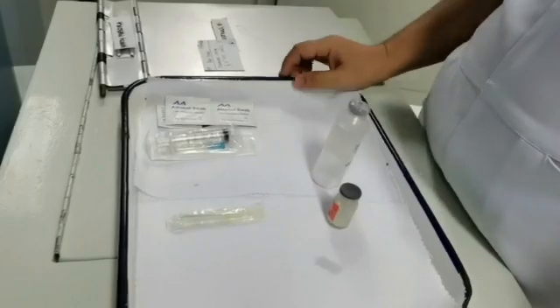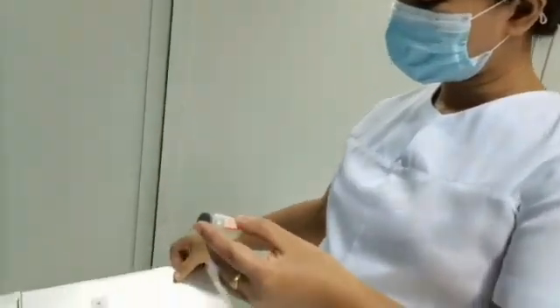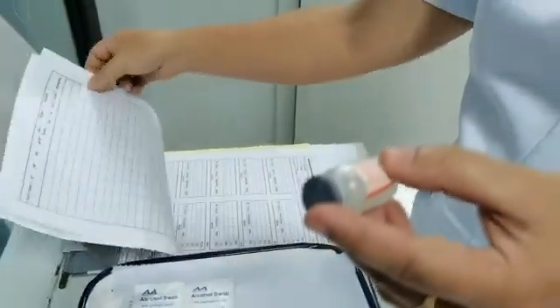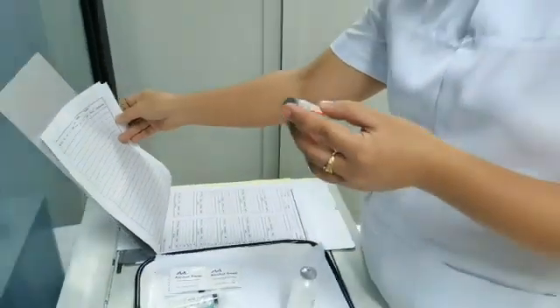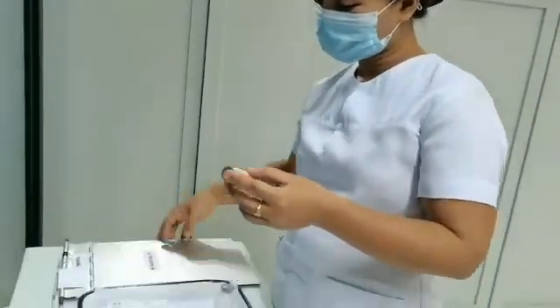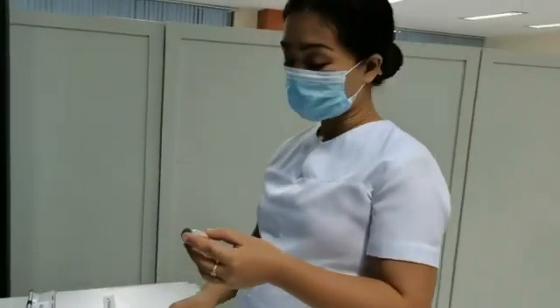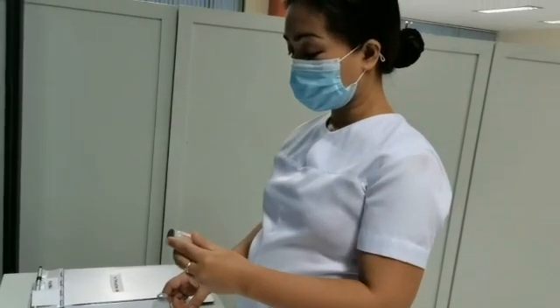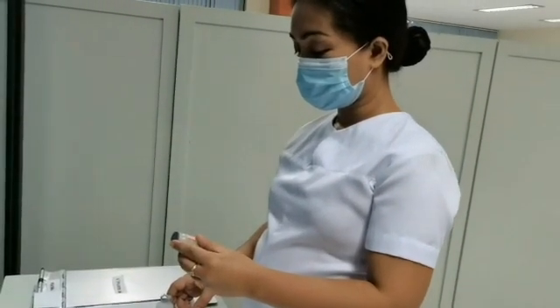Check label of medication vial with medication record or electronic medication record using 5 rights of drug administration. Perform dosage calculations if vial contains more medication than client requires.